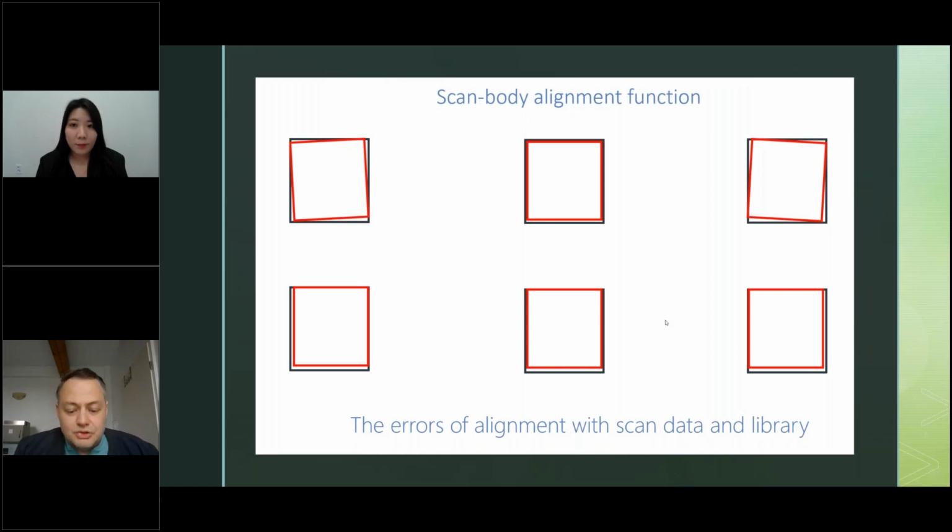But normally in the op stage, we need to have the emergence profiling, so the scan bodies are no longer present. If you do an occlusion alignment and what you have on the arch doesn't match what you have in the occlusal scan, you're actually giving trouble to the software that is trying to align both arches together. So my recommendation would be, occlusion is not recorded with scan bodies.